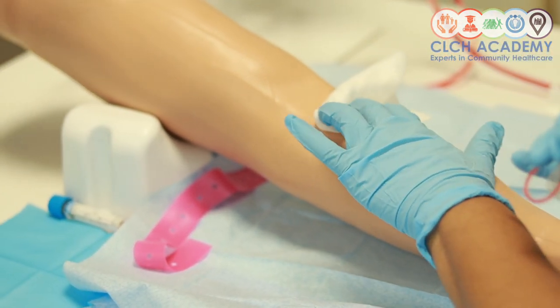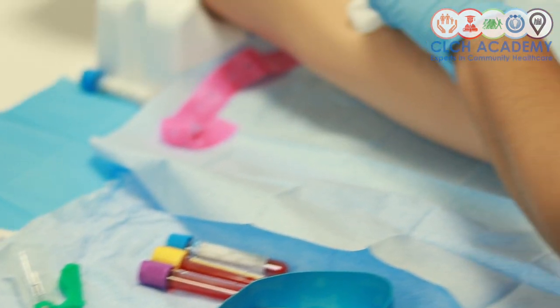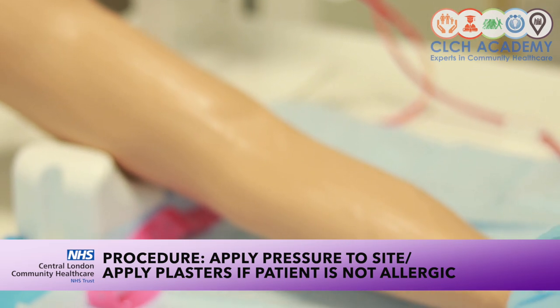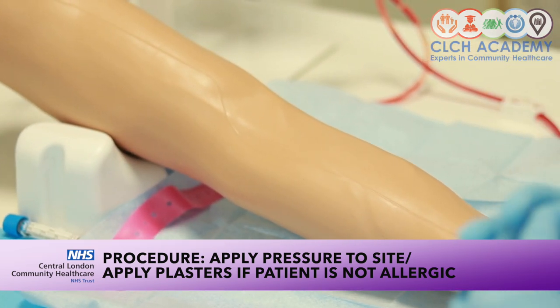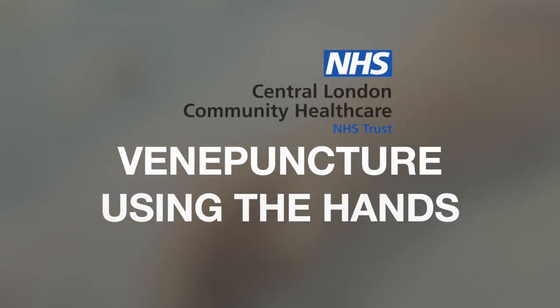And then I will dispose of this in my yellow bin, apply pressure for 2 to 5 minutes, and if my patient was still bleeding, I'd apply some elastoplast as long as they were not allergic to elastoplast. That brings us to the end of this session.